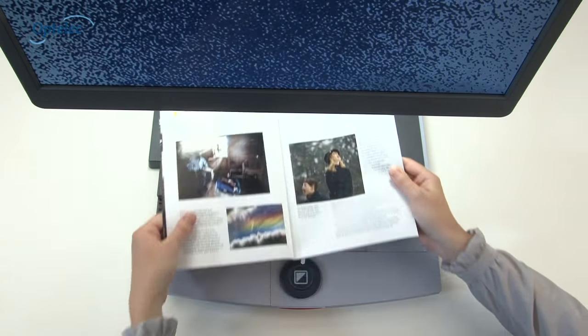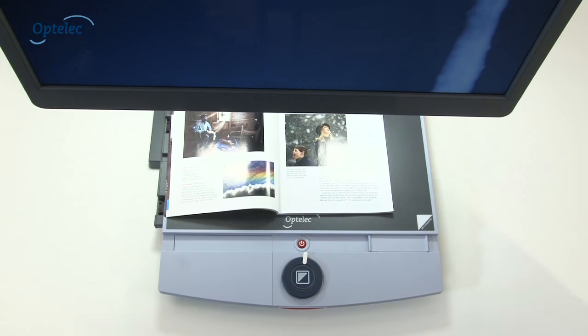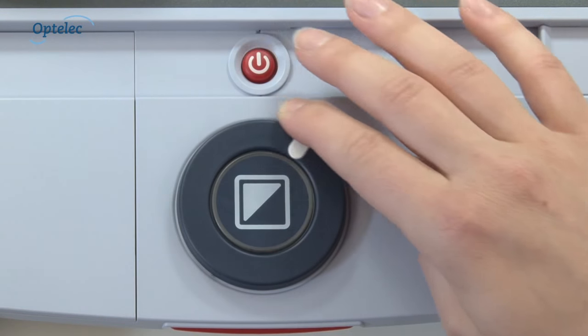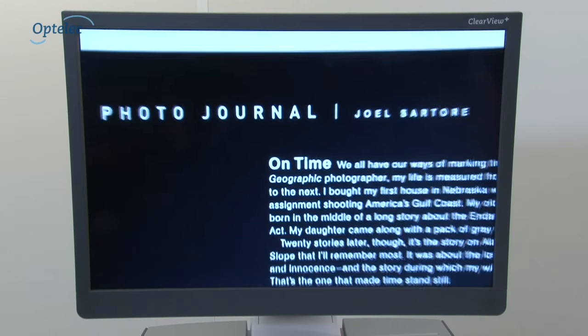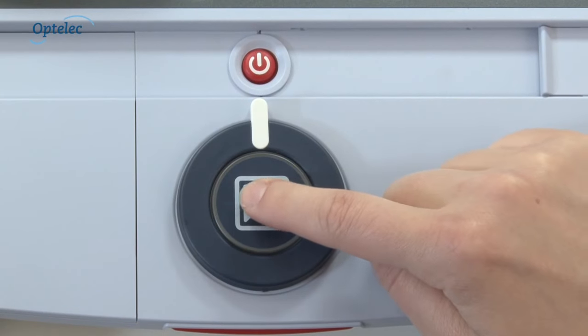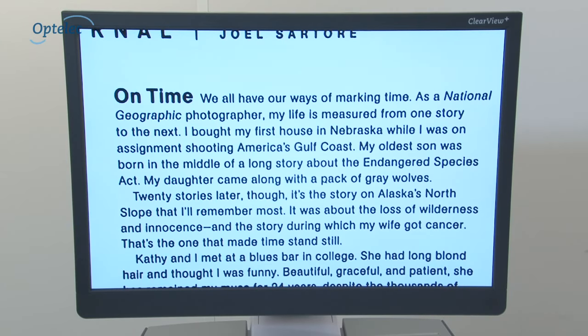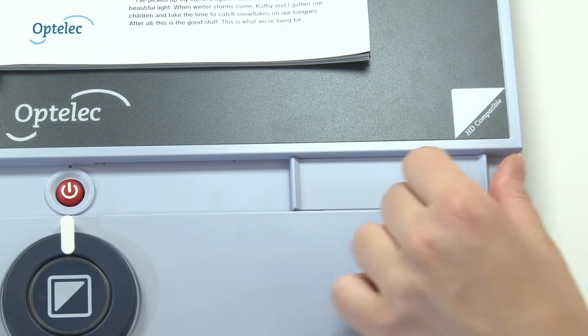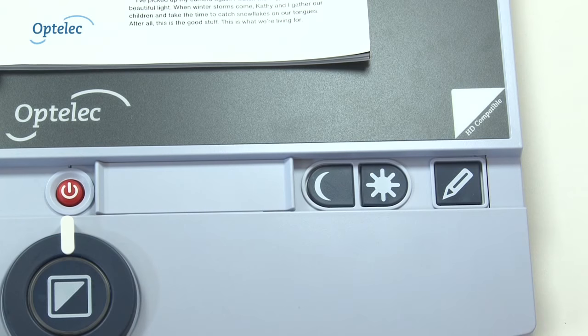Viewing and magnifying letters, newspapers, magazines and photographs is very easy. You can operate the Clearview Plus with one simple control. Turn the outer control to magnify text and photographs. Make text more visible using one of the enhanced contrast settings at the press of a button. Other adjustment buttons are hidden behind a cover on the reading table.